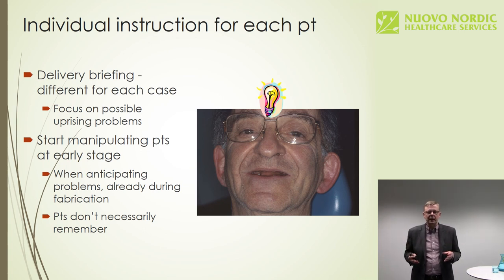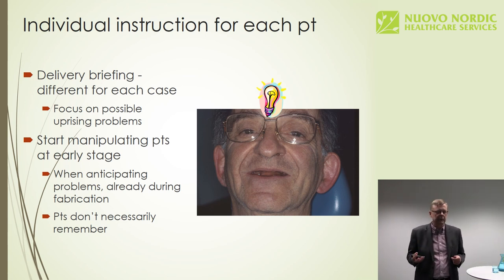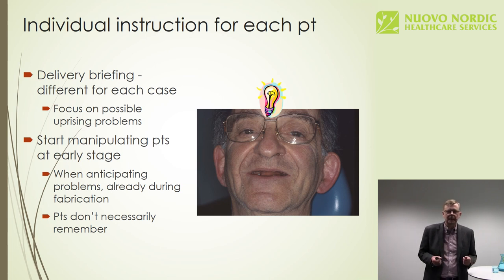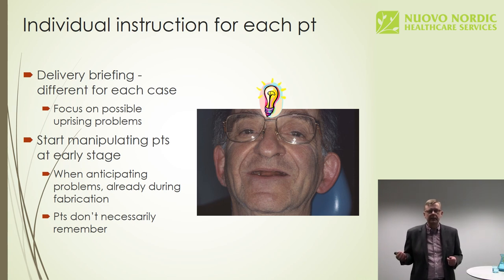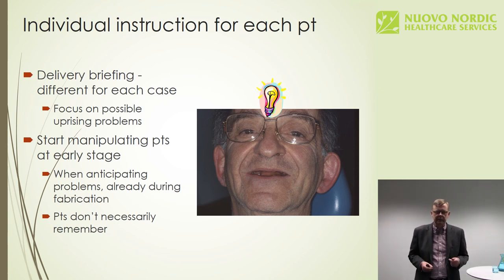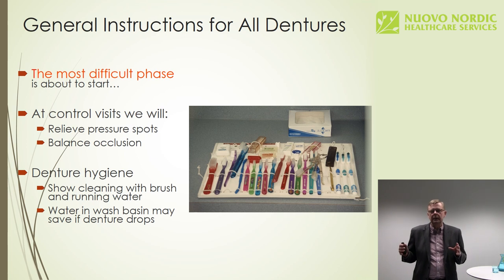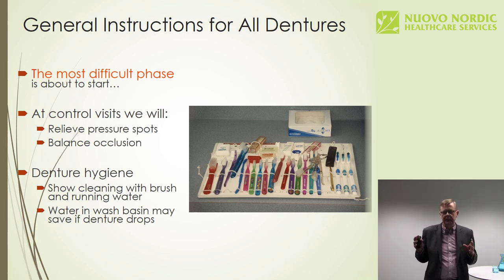When you give the instructions, of course, there are specific instructions for all different kinds of dentures. Now we have a complete denture and a partial denture. Whether you have fabricated a bridge, a fixed partial denture, or as we nowadays say, fixed dental prosthesis, or a crown, or an implant prosthesis, you always give different kinds of instructions. One common piece of instruction is the cleaning with all prosthesis.